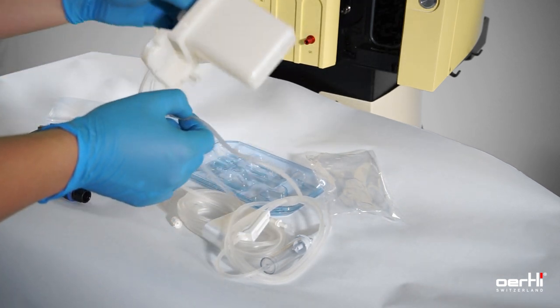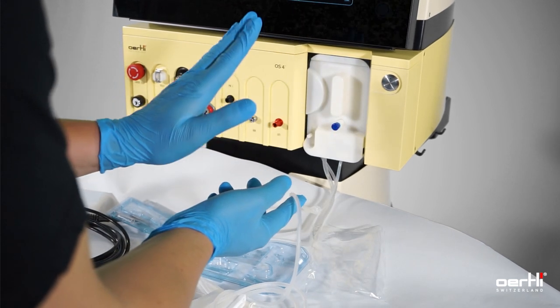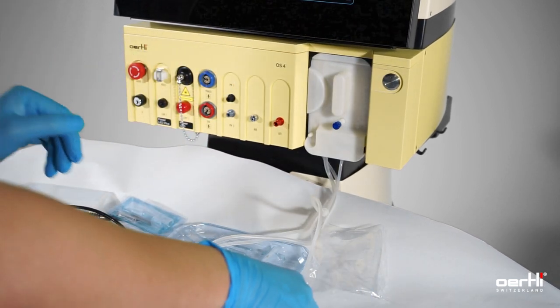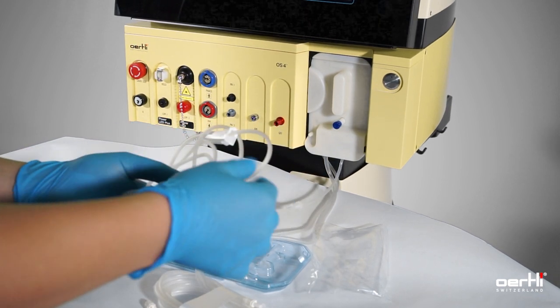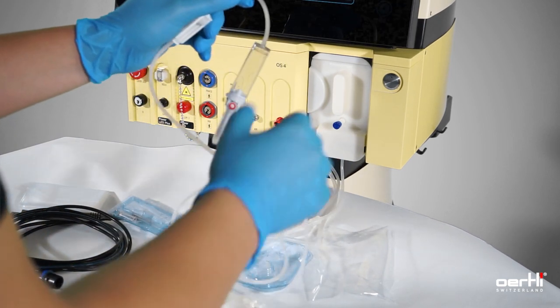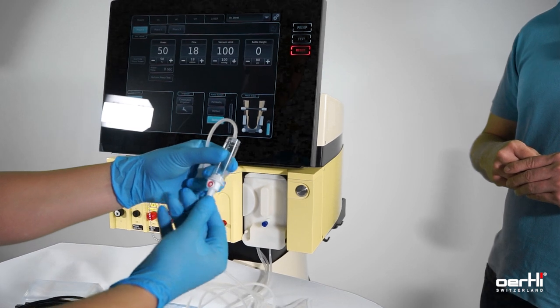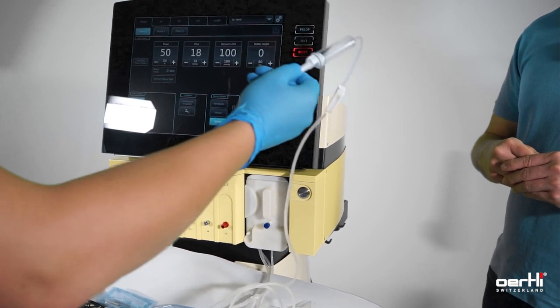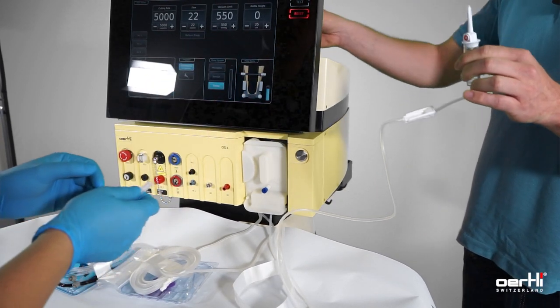Prepare the cassette in the shaft without pushing it in all the way yet. Hand over the drip chamber by holding the cover here, and hand it to the jumper — he pulls it off.